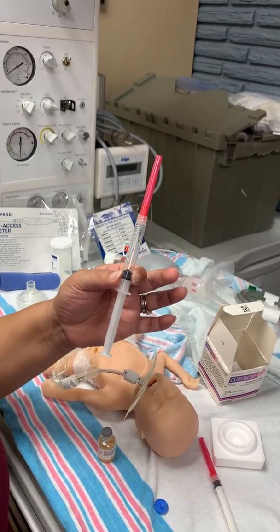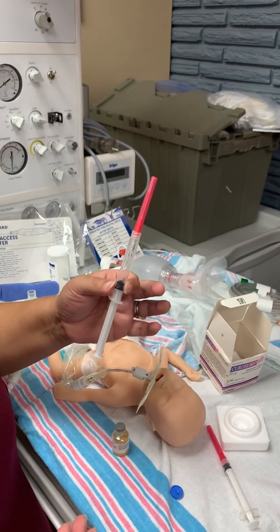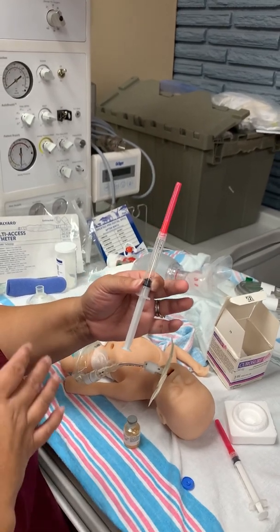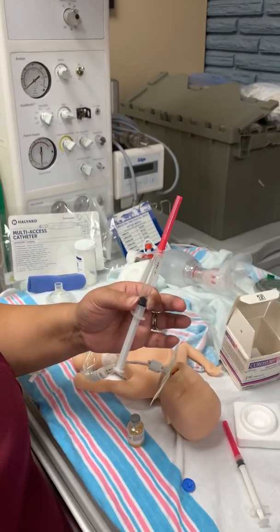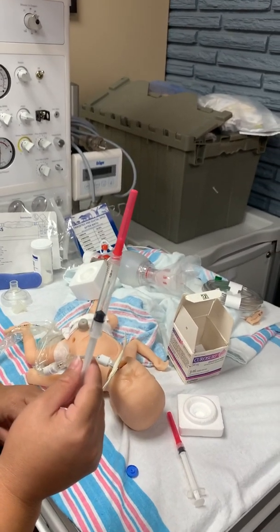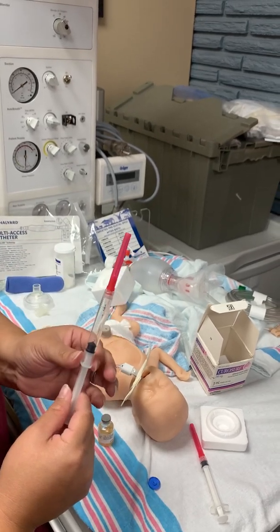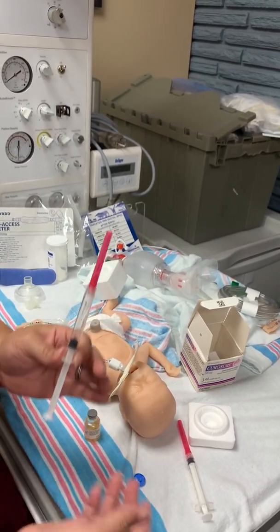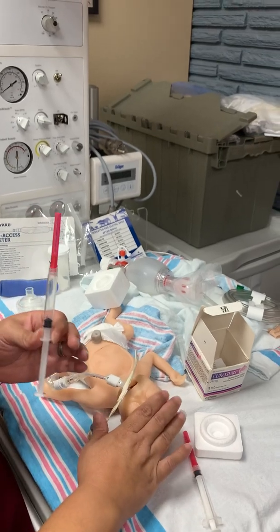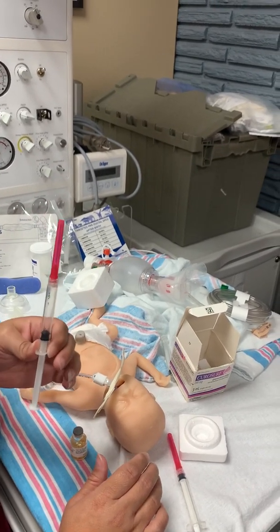We're gonna give 2 aliquots, or in theory, 2 doses. One dose is going to go to the left lung, the other dose is going to go to the right lung. So even though I have 3 mLs total in here, what I'm gonna do is actually transfer half of the dose of what's prescribed to the patient. So if this is my 1 kilo patient, it's still 2.5 mLs. So half of 2.5 is 1.25.